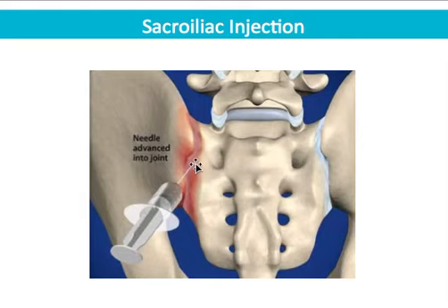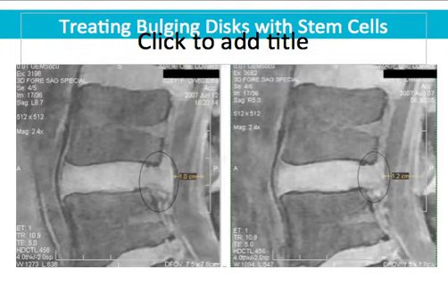You're going to push the needle in about an inch and a half. You'll feel some gumminess. You infuse a half a unit there, pull it out, and then fan it with the needle facing almost at a 60-degree angle, and the needle is actually directed inferiorly, so it gets the rest of that joint, and you just fan it through that entire joint capsule. You put 1 ml for an SI joint. Unless the SI joint's not too bad, you can start with a half, but typically it's going to be 1 ml.